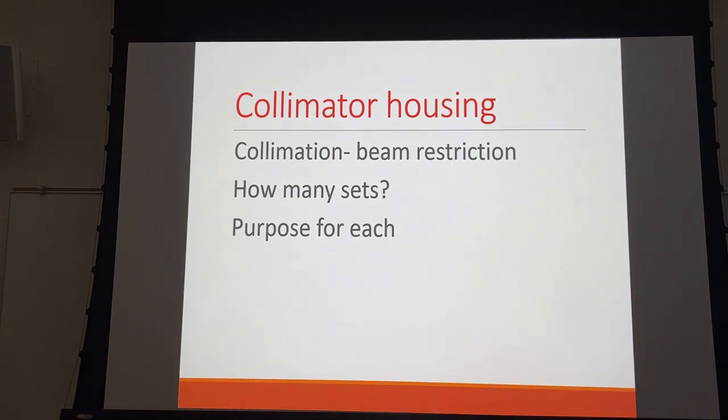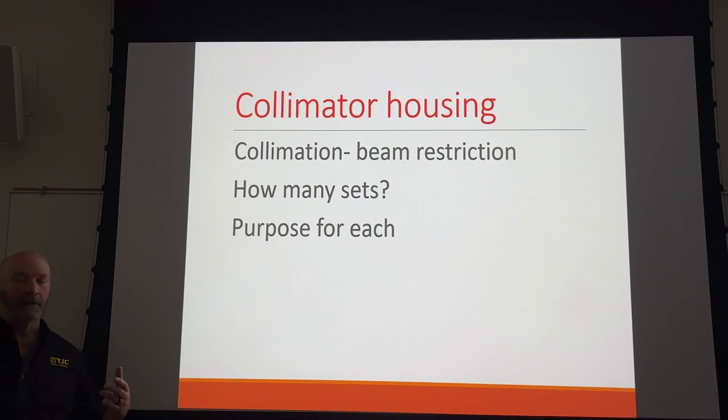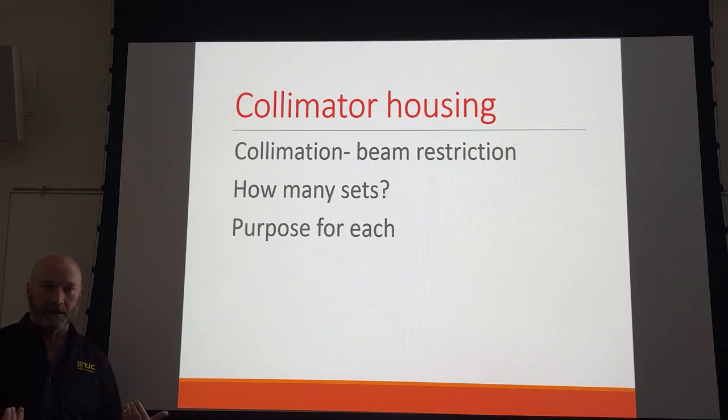All right, so collimators. Another leap that you're going to have a tendency to make is what collimation does and what it doesn't do. So remember, X-rays behave like light in a lot of ways, and in some ways they do not. With light, we can focus light, right? Laser beams are just focused light. We can't make an X-ray laser. We don't focus X-rays. We just block X-rays, right?